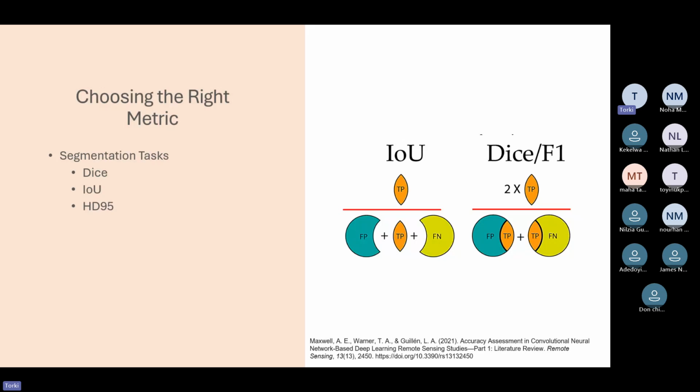So this is for accurate boundary prediction, and it is very important in many applications. You're not just doing overlap without actual boundary alignment. You'd like to have both overlap and boundary alignment. For Dice and IOU, the higher the better, but for HD95, the lower the better. Any questions on these evaluation metrics?